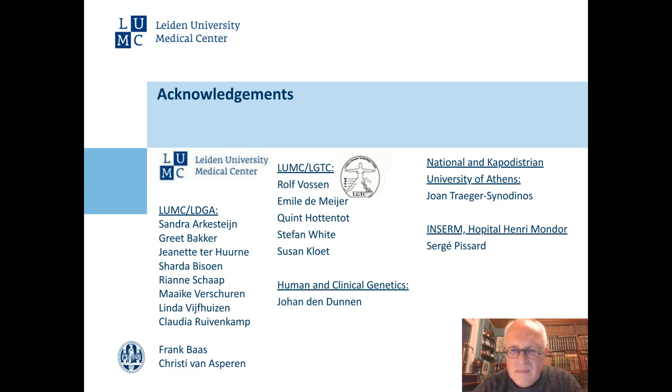Okay. Any advice for diagnosing beta thal trait in newborns? This is from Maria, Harry Medical College. That's a very good point. At birth, the A2 is not visible, so for a newborn, it is not possible to look for elevated A2.